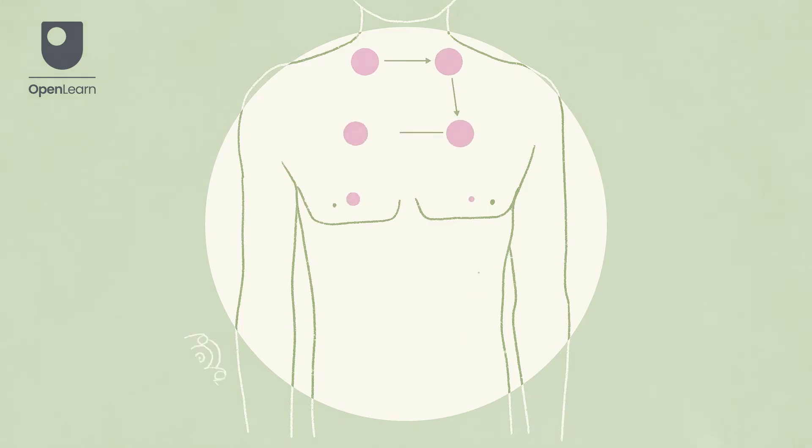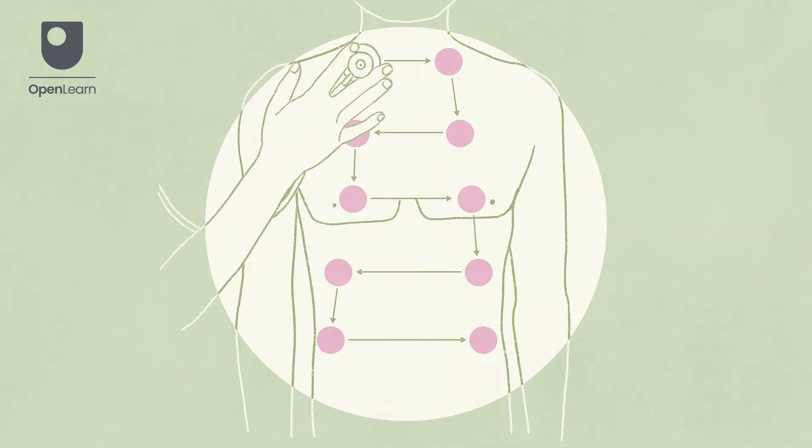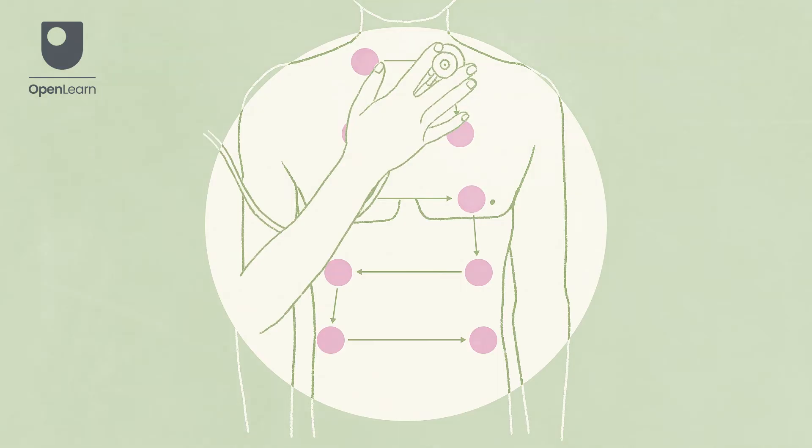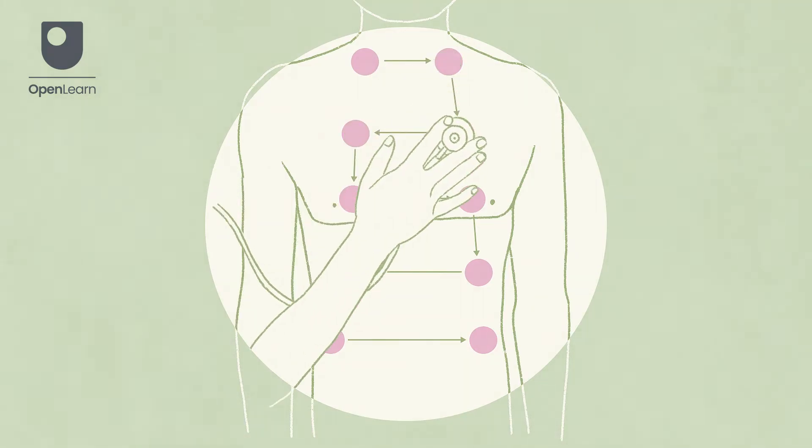Start at the front of the chest. Place the diaphragm of the stethoscope on the right-hand side of the patient's chest at the first intercostal space. Now use the stepladder approach to move your way down to the bottom of the chest.